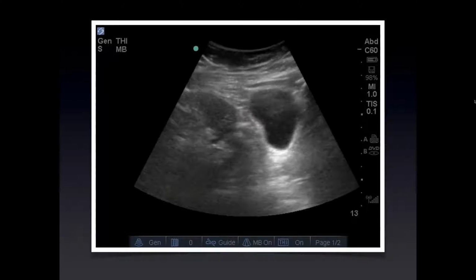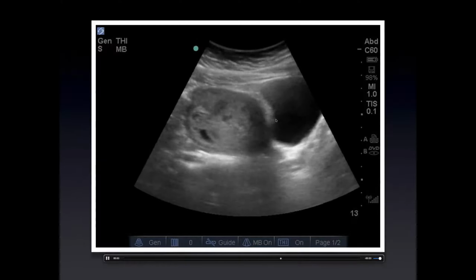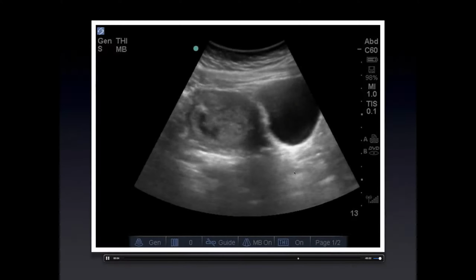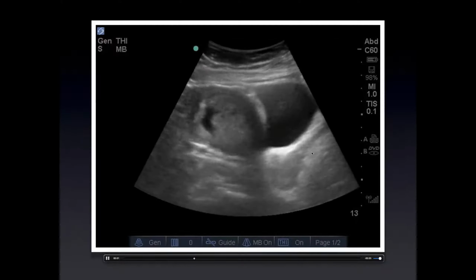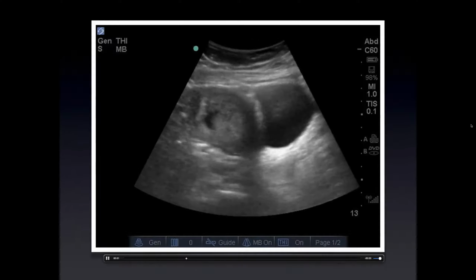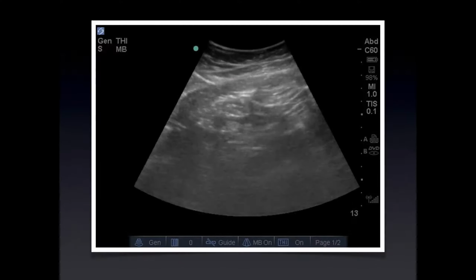All right, case 3. So here we're seeing the bladder and uterus on a transabdominal ultrasound. Again, this is sagittal plane. It connects to the cervix right here. Vaginal stripe is seen right here. Within the uterus, we see a thickened endometrium, and we see some fluid, so possibly a gestational sac, but certainly no yolk sac within it, so we do not see a definitive intrauterine pregnancy.